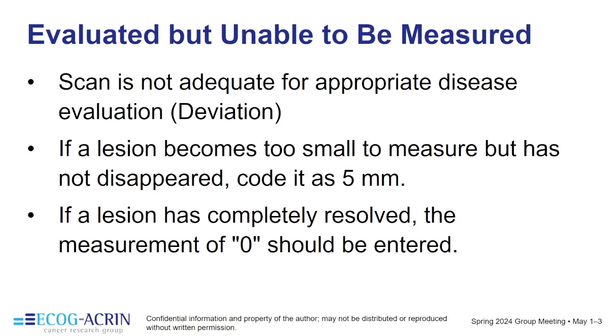Or if a lesion has completely resolved, a measurement of 0 millimeters should be entered. So please make sure about the other 2 before checking "evaluated but unable to be measured," because you will be queried to confirm.